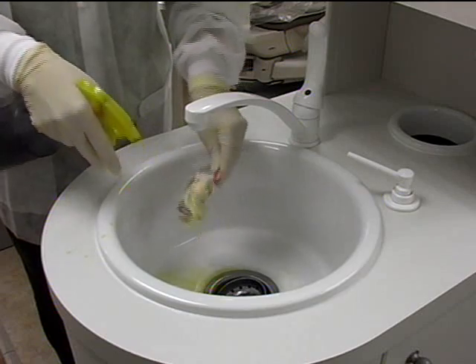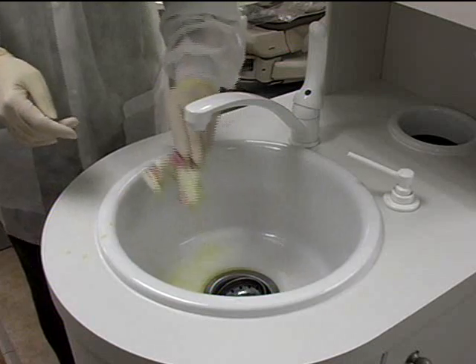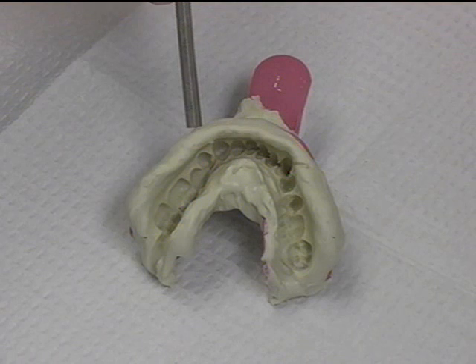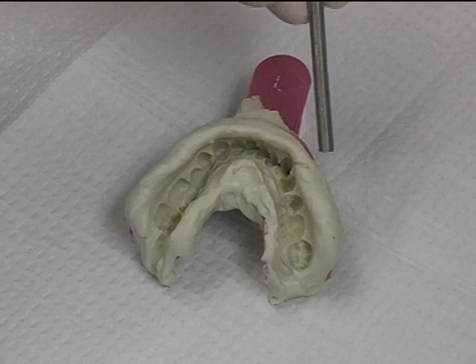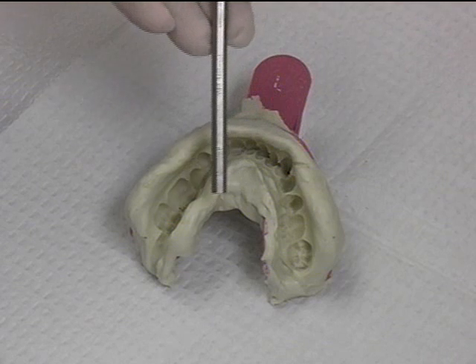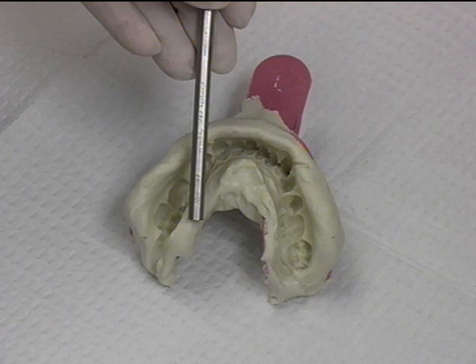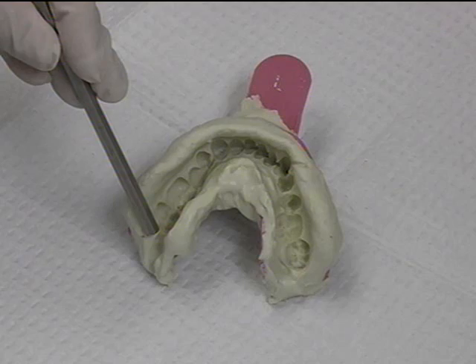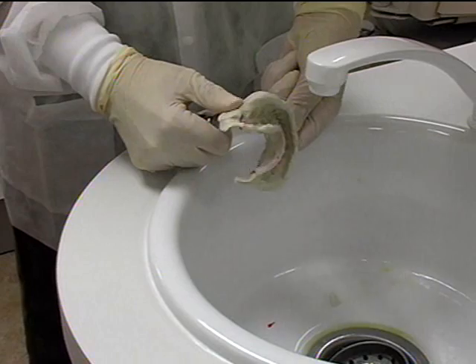Shake off excess solution and inspect for detailed reproduction of hard and soft tissues: vestibular roll, buccal, labial and lingual frena, lingual vestibule, retromolar pad area, and no voids. Remove unsupported material with a knife.